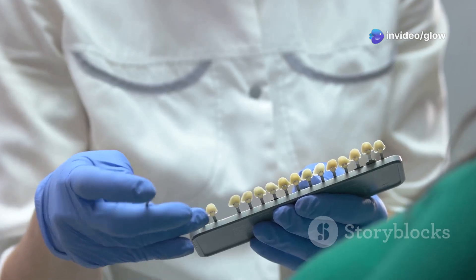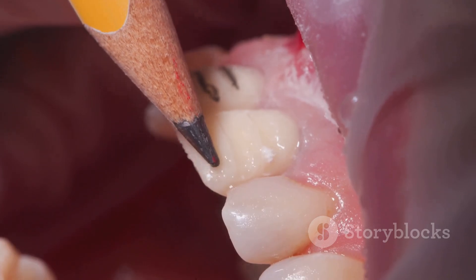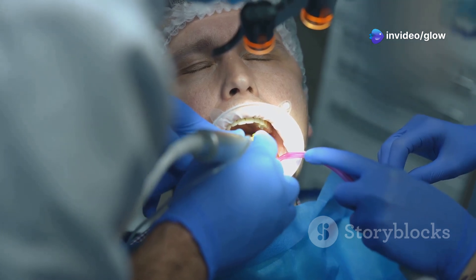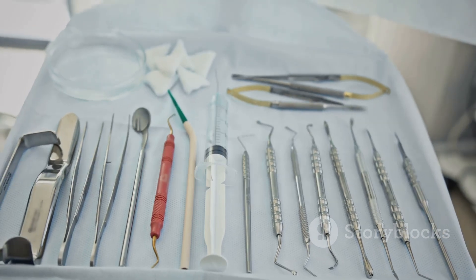Now let's get into the steps, and we're following GV Black's classification here. Step one: the outline form — think of this as the blueprint. You're defining the cavity shape at the tooth surface, removing all decayed enamel and dentin, including any weak pits or fissures, and making sure your instruments and materials can easily do their job.